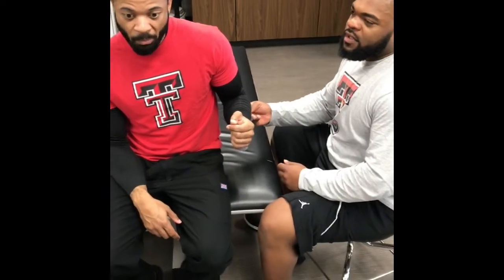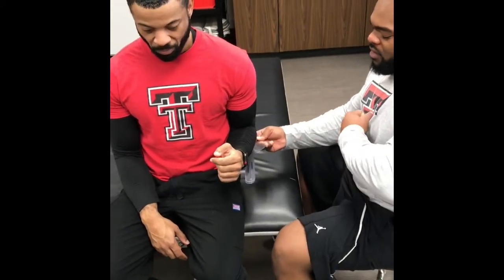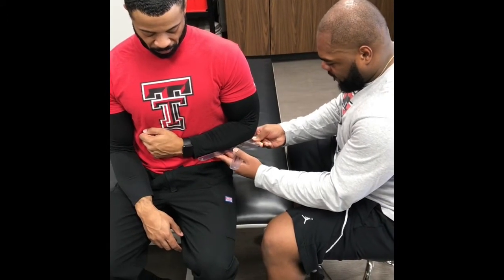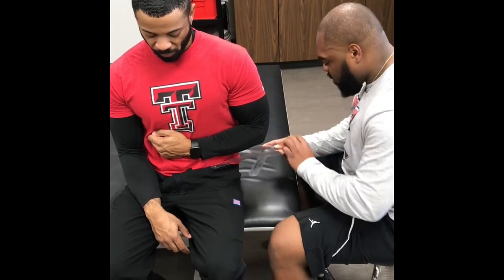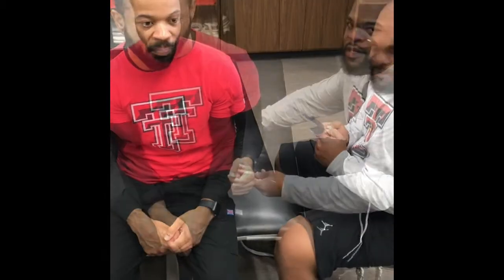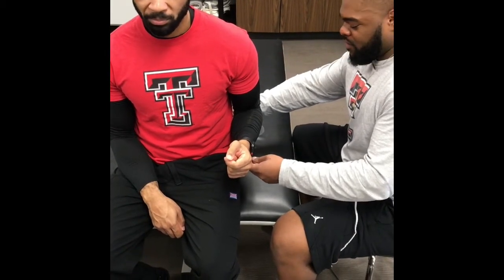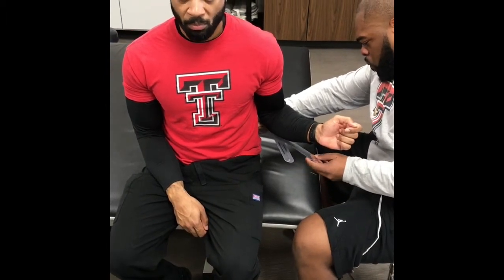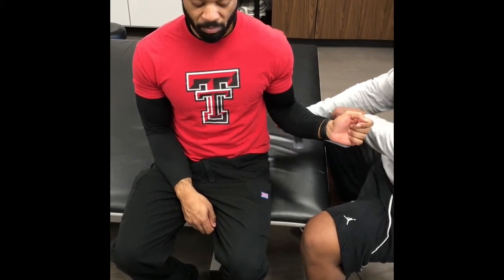Now we're about to do shoulder internal rotation, so if you would please sir, bring your arm out like that. Normal is 0 to 80, and he is at 70.